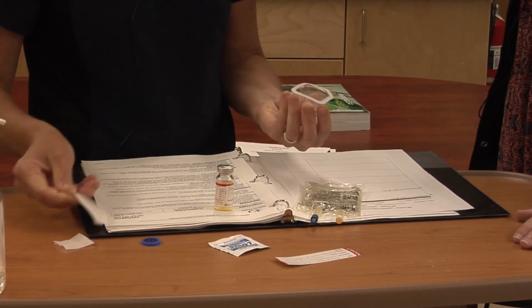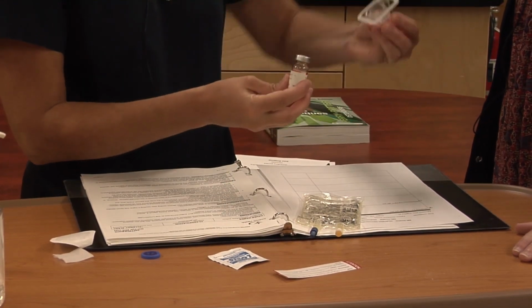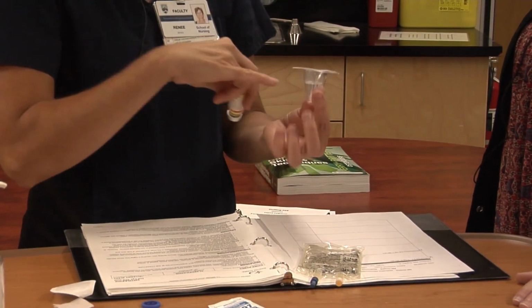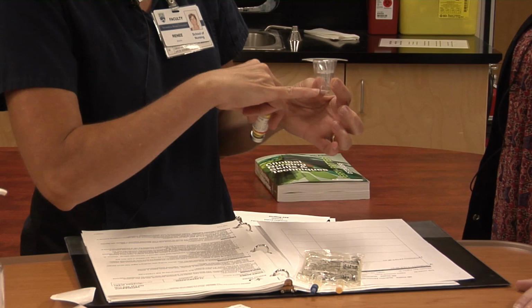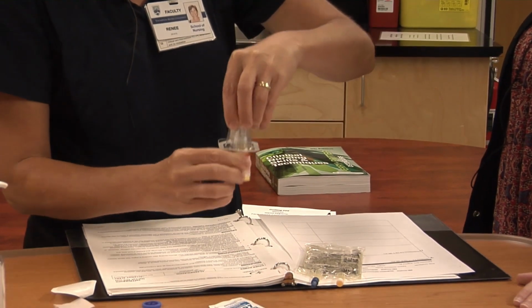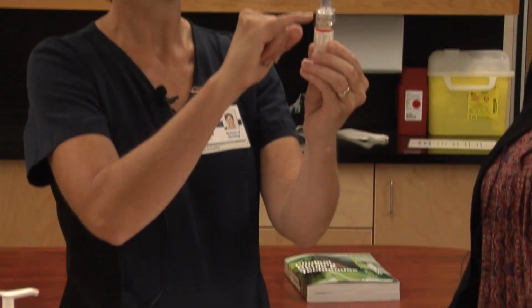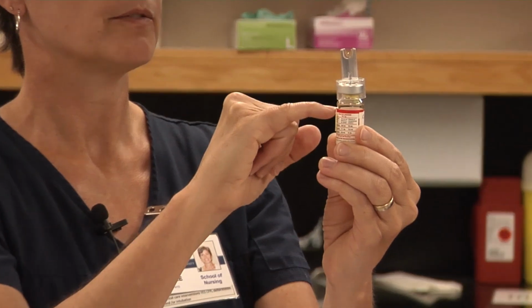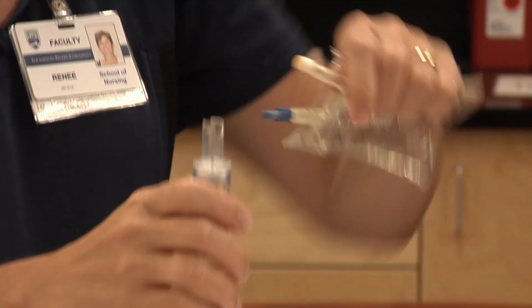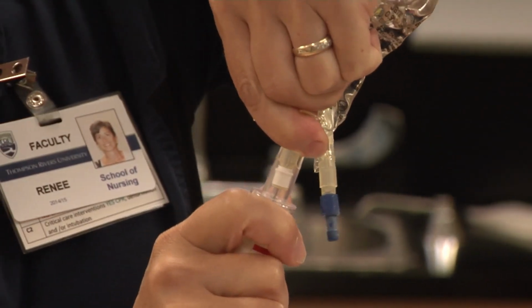So thinking about principles of asepsis, we're going to go this onto the drug as opposed to the drug onto there. If we do it that way, sometimes what happens is you end up with a little bit of medication in the bottom and there's no way to retrieve it. Okay, so we're just simply going to stick it on there. So what is happening is there's a little needle that has pierced the rubber dam of our vial, plus the needle is up here because we're going to take our mini bag, we're going to shove it through there.